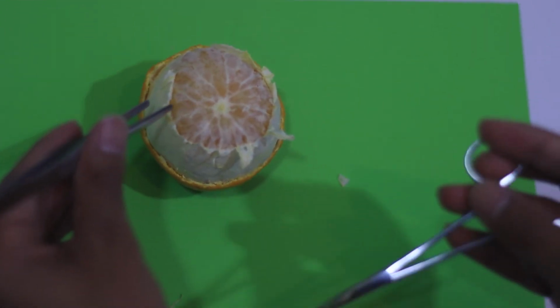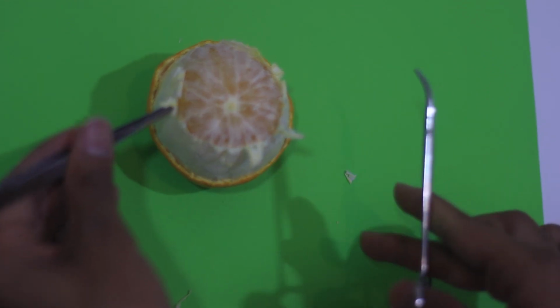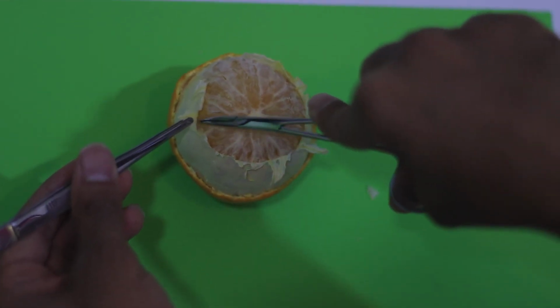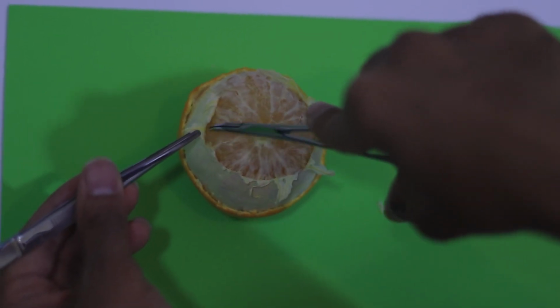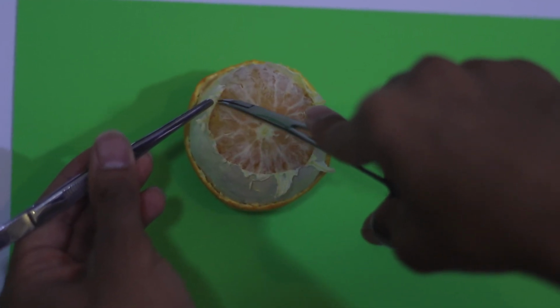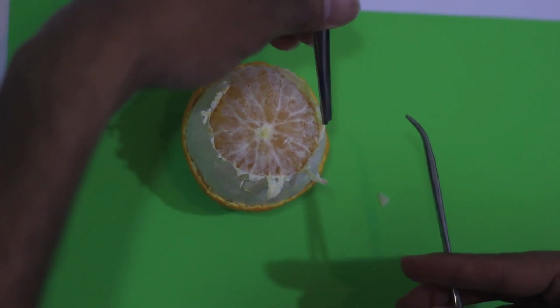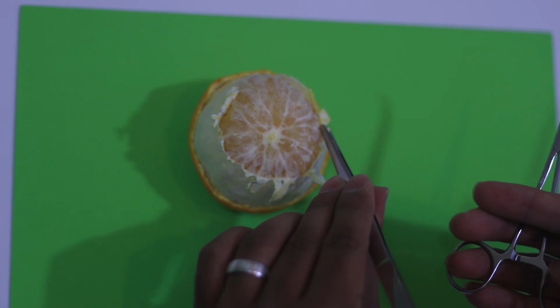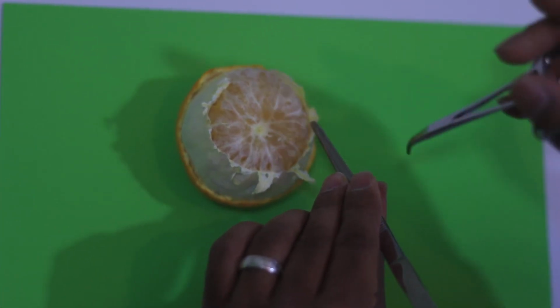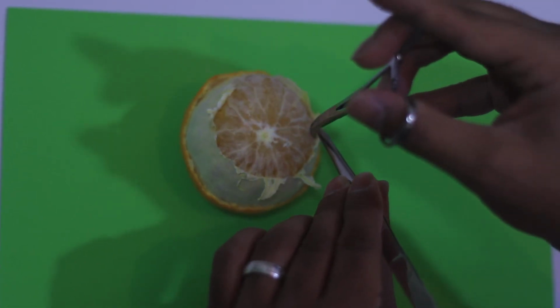And if you go to the more delicate tissue, actually you try to dissect the orange, so you feel yourself more controlling on the dissection. You can just get the plane in all the directions. You see here an example for this one. I cannot do it like this, so what I will do is only dissecting like this.